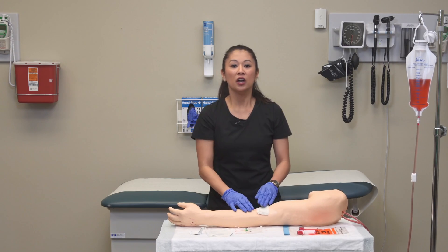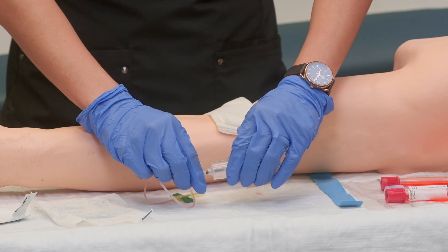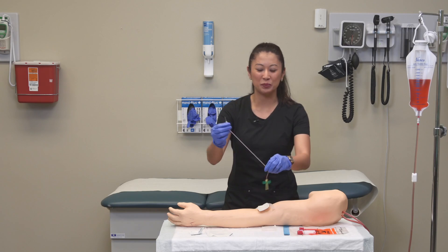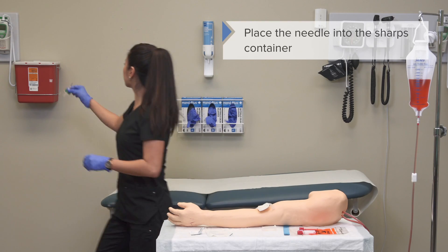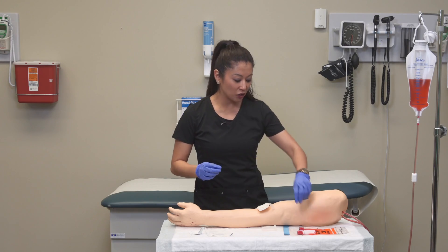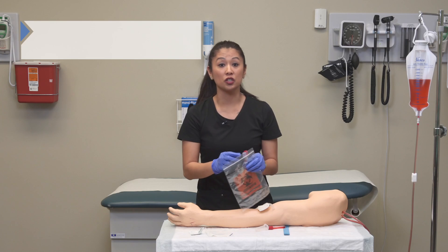Now remember to take your needle, remove it from the blood collection device, and place it into the sharps container. Once that's done, it's a good idea to gently invert our blood collection tubes.